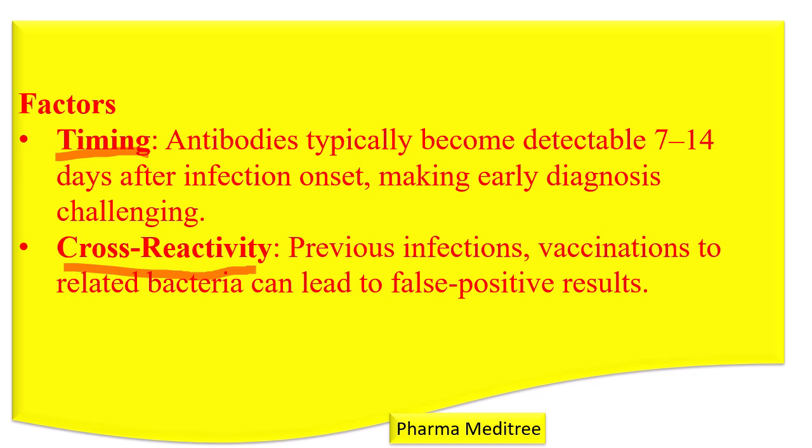Cross-reactivity. Previous infection or vaccinations to related bacteria can lead to a false positive result. If you are suffering from any infection or have had vaccination to typhoid or paratyphoid bacteria, it can give you a false result. So keep in mind, if you are suffering from an infection or vaccination, please avoid the Widal test for accurate results.